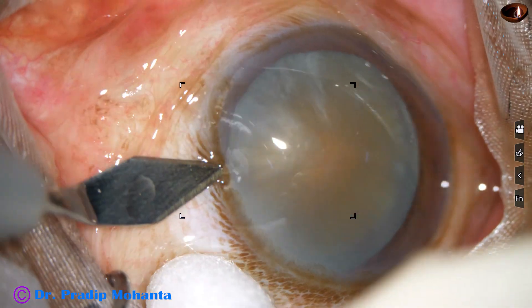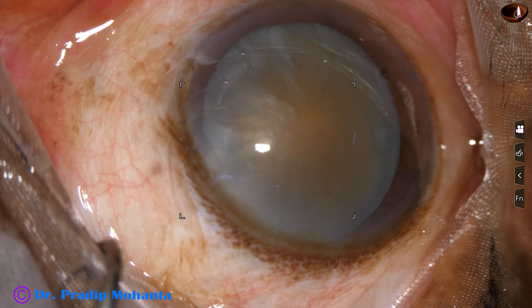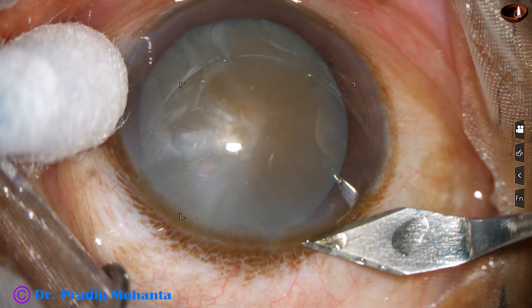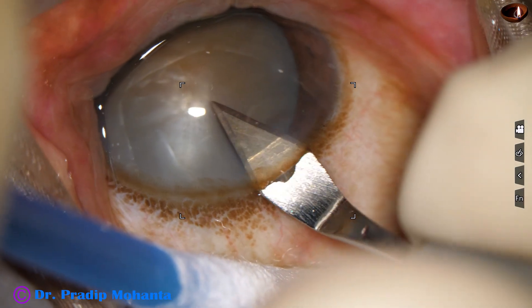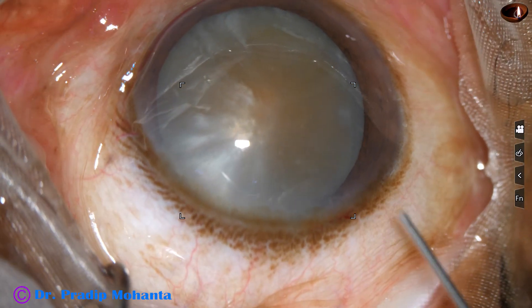The side port has been made first in this case by the keratome itself. Width of this side port is about 1.9 mm. This is the main incision — the keratome goes full and this is a 2.8 mm incision.